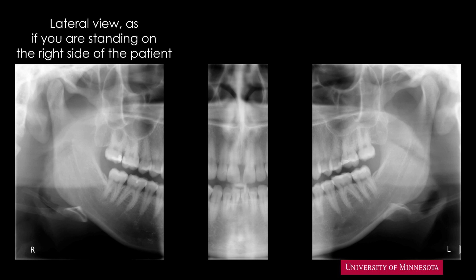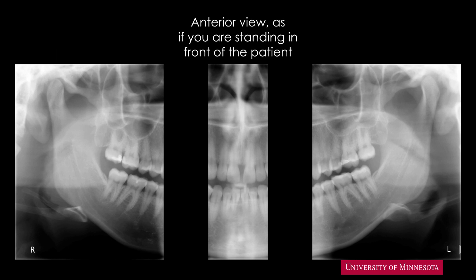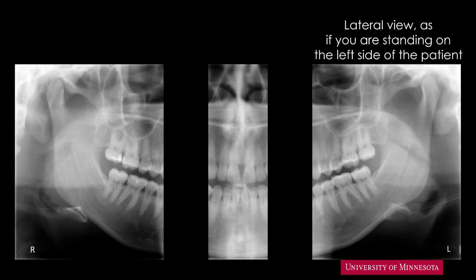You should also remember that the panoramic view of the condyle is not a true lateral presentation. But for now, we'll proceed considering the right side as a lateral view. The patient's cervical vertebra is on the left edge of the screen. Let us consider the central part of the image as an anterior view, as if we are standing in front of the patient. In this view, the patient's cervical vertebra is behind the computer screen.